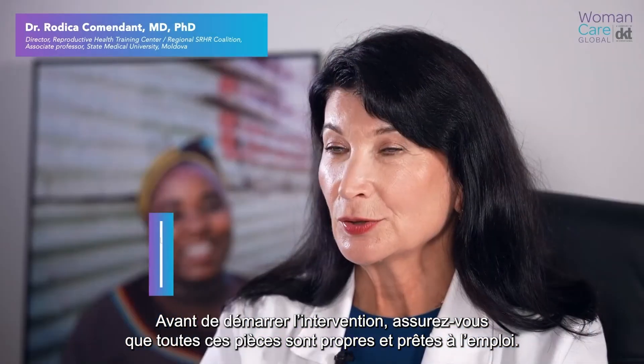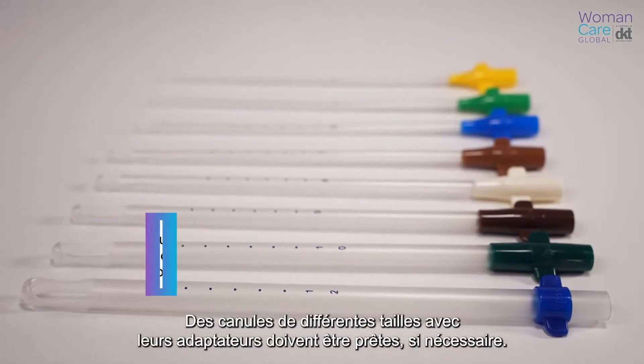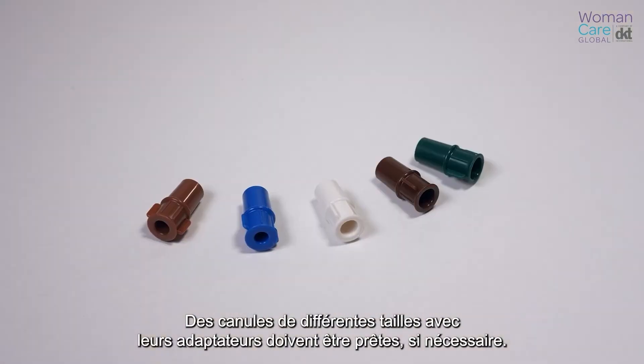Before you start the procedure, ensure that you have all these parts clean and ready. Have cannula ready of different sizes with adapters if needed.